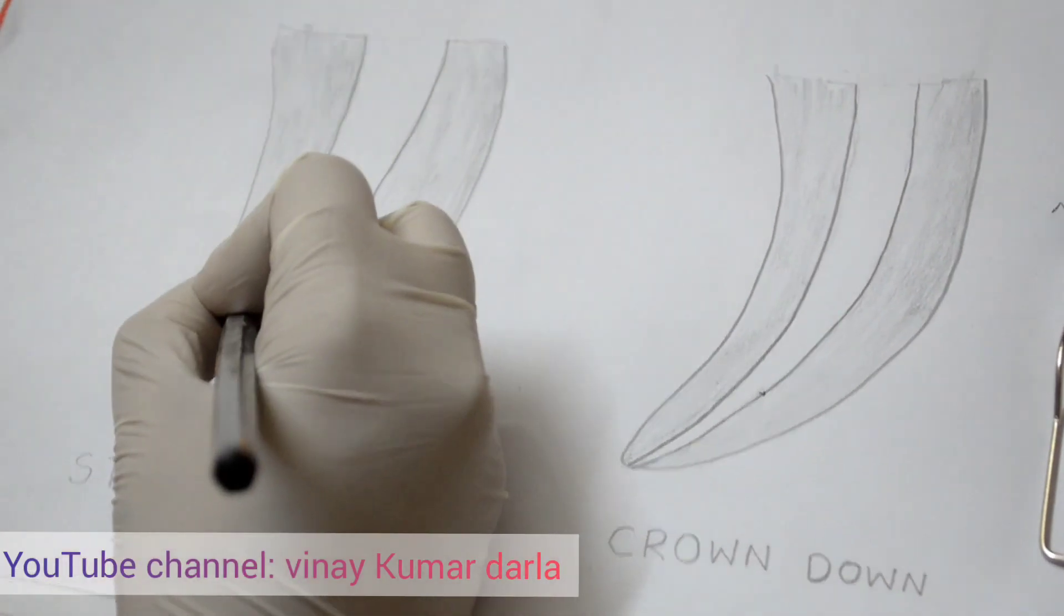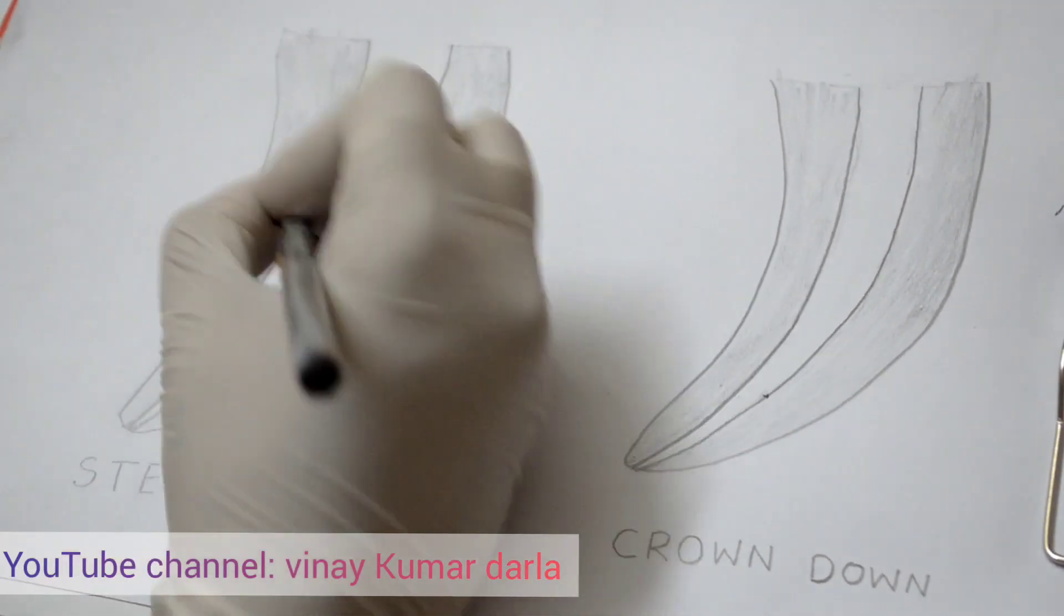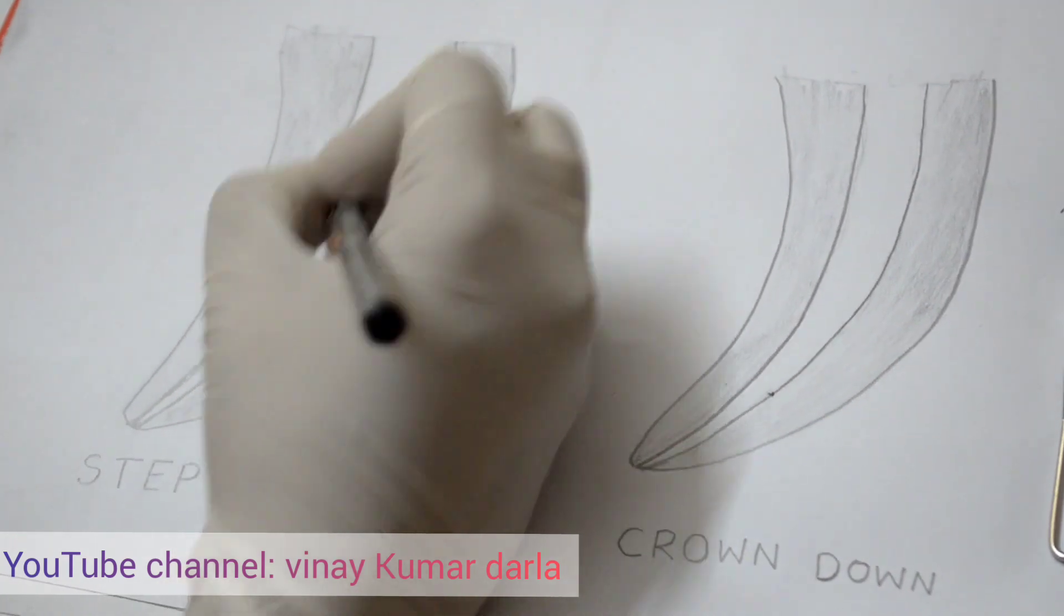In a crown down pressureless technique, instead of using H files for initial preparation, a 35K file is used to the point of canal binding.